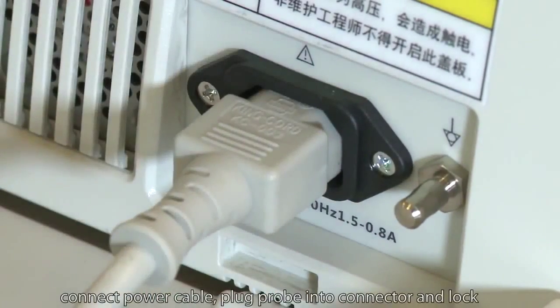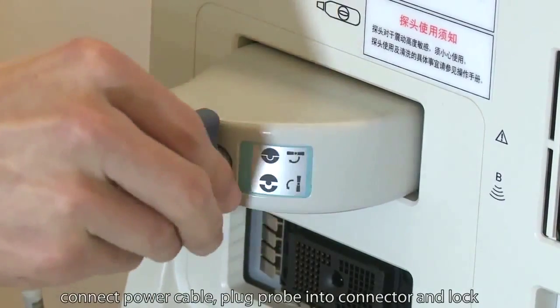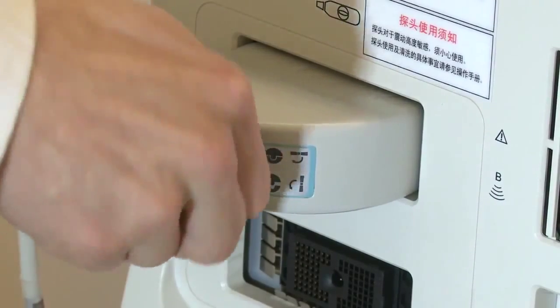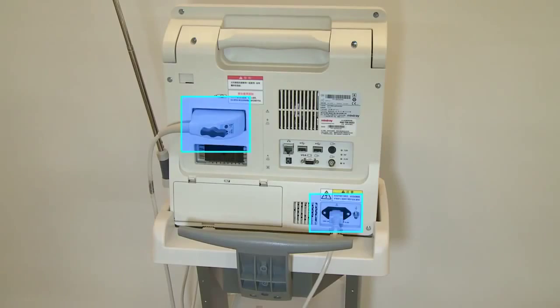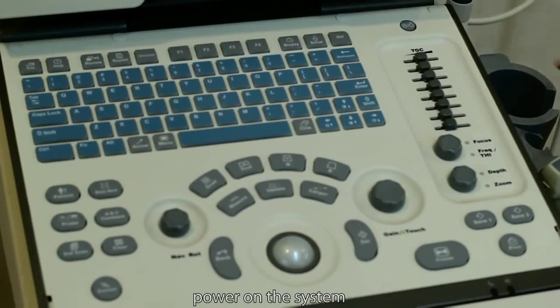Connect the power cable. Plug the probe into the connector and lock. Then power on the system.